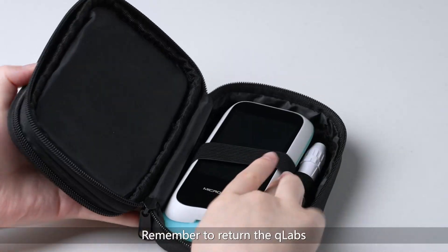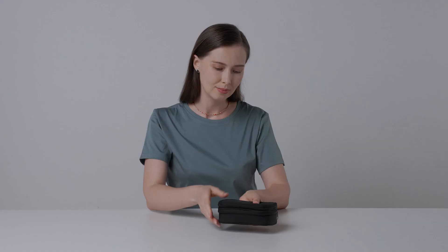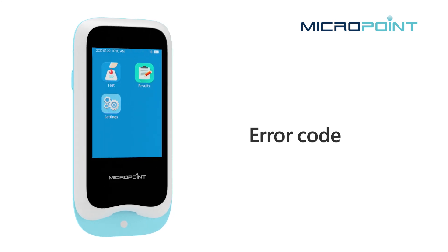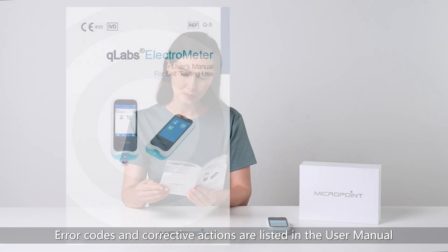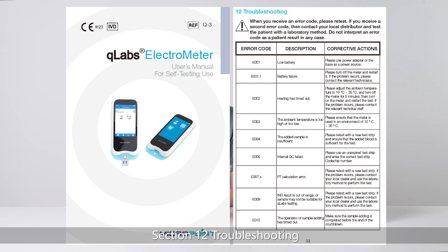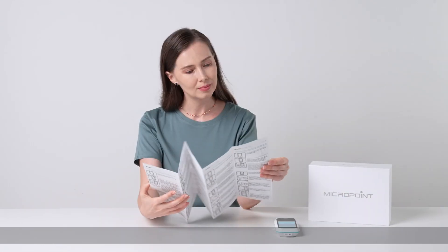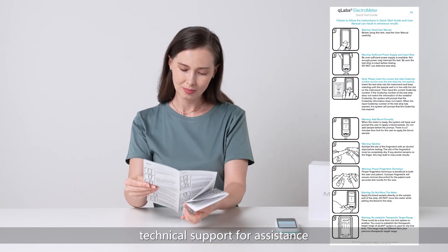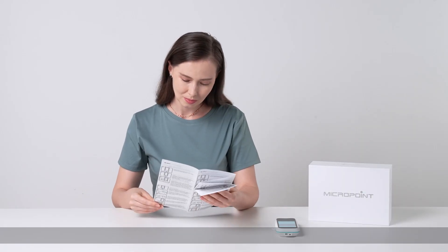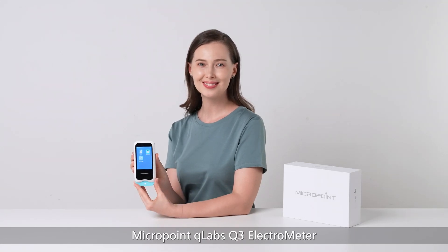Remember to return the Q-Labs to the protective carry case for storage. Error codes and corrective actions are listed in the user manual, Section 12 Troubleshooting. When you receive an error code, refer to the list and retest. If you receive a second error code, contact your local distributor or Technical Support for assistance. Thank you for choosing the MicroPoint Q-Labs Q3 Electrometer.